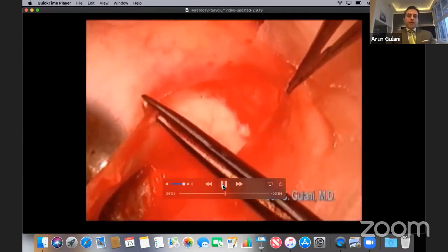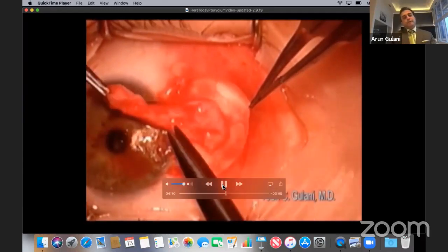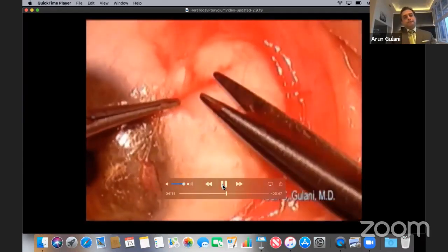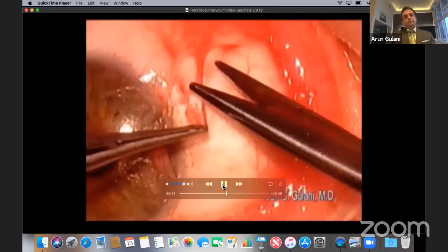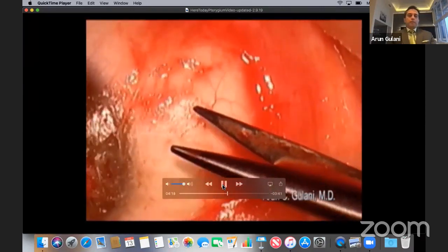Literally, it comes into your hand as you cut the tentacles. You don't have to chop the entire lesion. At this point, also trace any evidence of previous leftover pterygium that can be removed. Peel off the corneal scar. No cutting, peel off, please.